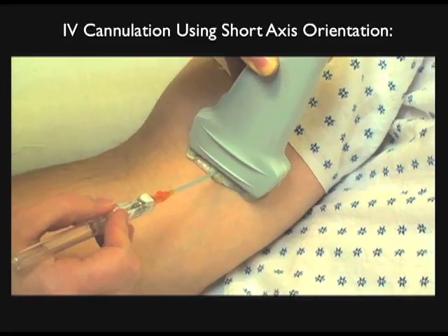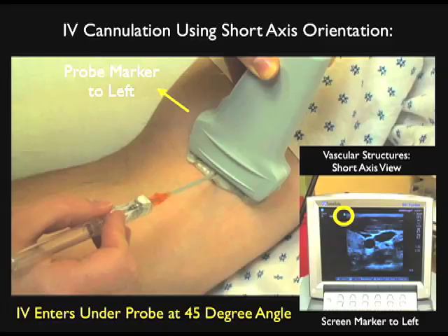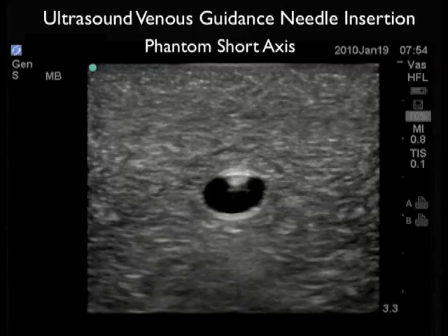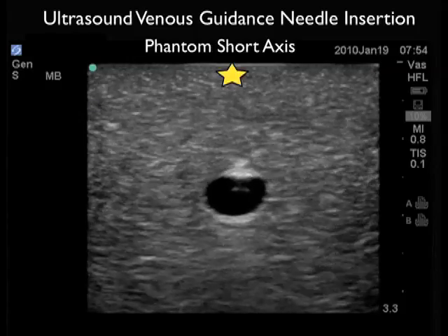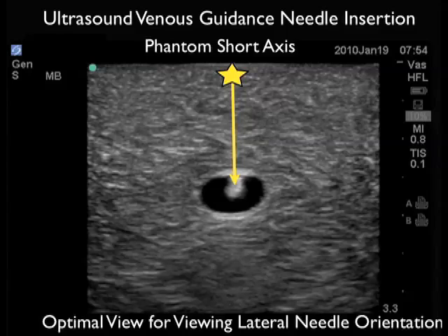Now we're ready to cannulate a vessel using ultrasound guidance. We'll begin using the short axis or side-to-side orientation of the probe, with the probe marker oriented towards the left as we stand in front of the patient. This will correlate with the ultrasound screen indicator dot towards the left of the screen. Generally, I want to place the IV at a 45-degree angle underneath the patient's skin and then place the probe over the area of the IV to guide it directly into the vein. Here we can see a target vessel and note the echogenic tip of the needle going through the anterior wall of the vessel and permeating into the vessel lumen. The short axis technique is optimal for viewing lateral needle orientation across the patient's arm.